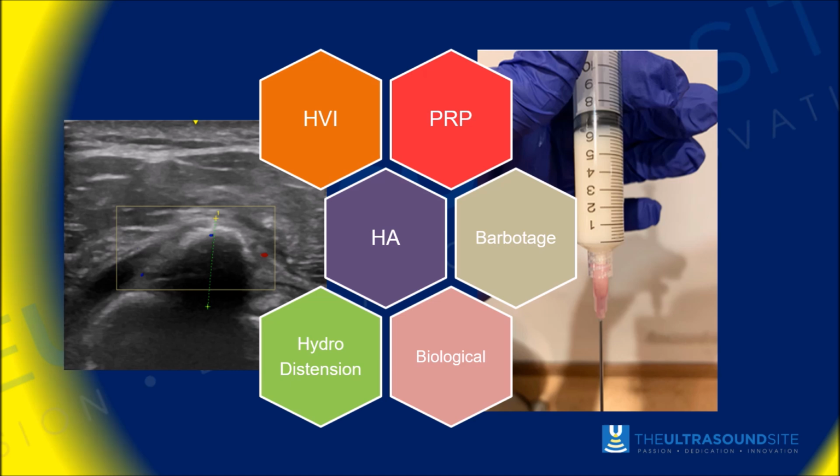And certainly, although there are very few studies out there currently looking into this, could we reasonably and realistically perform a barbotage procedure without ultrasound guidance? Could we realistically perform a high volume stripping procedure without ultrasound guidance? So the current move towards some of these more technical and innovative treatments may have more requirements for ultrasound guidance. That's something, again, that we must bear in mind.